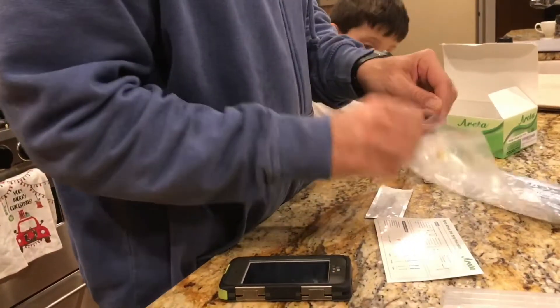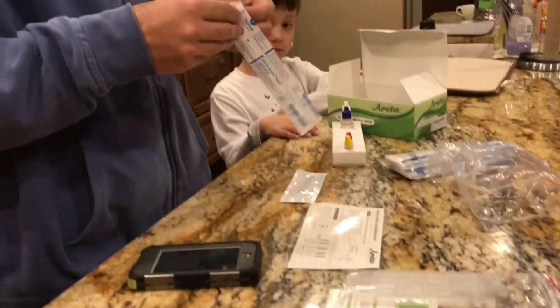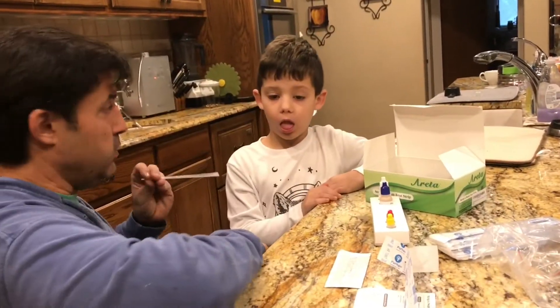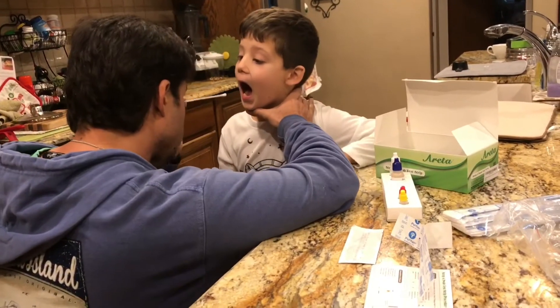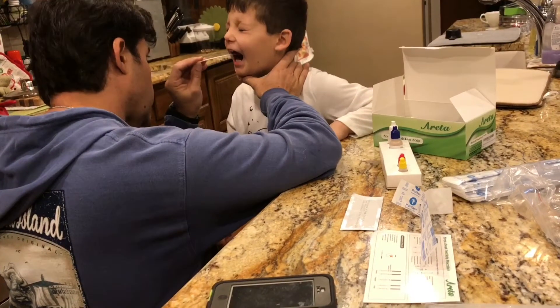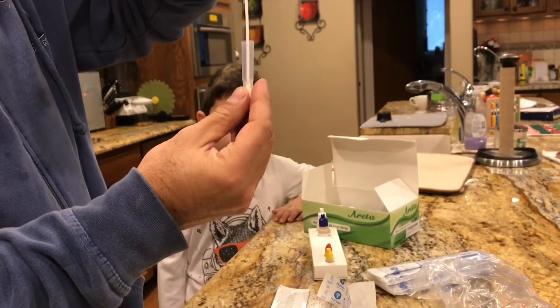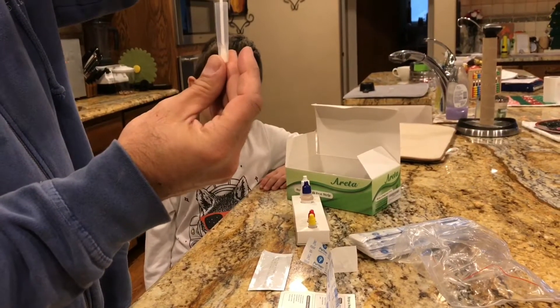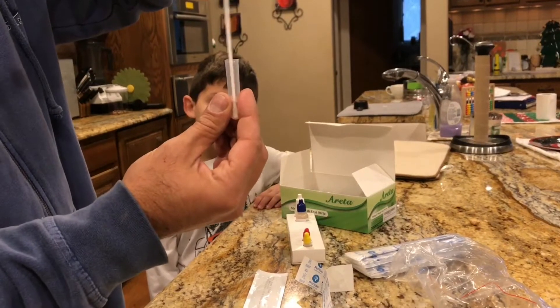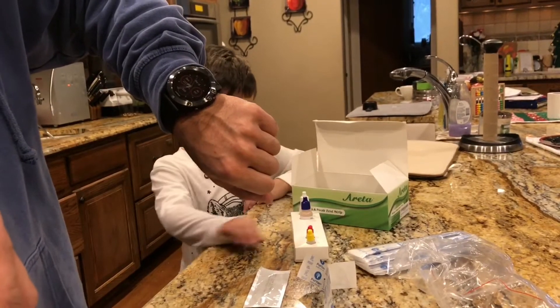The swab is just a cotton swab that comes in the kit. Okay, you ready buddy? This is probably the hardest part for my little man. Say 'ah,' stick your tongue out — okay, we're going to get a good one. Now stick this in the tube and rotate 10 times: one, two, three, four, five, six, seven, eight, nine, ten. And we're about 10 seconds in, so we'll let this sit for one minute like it says.